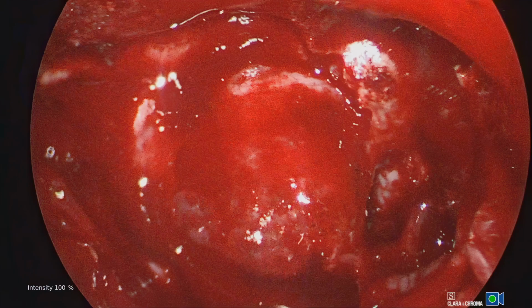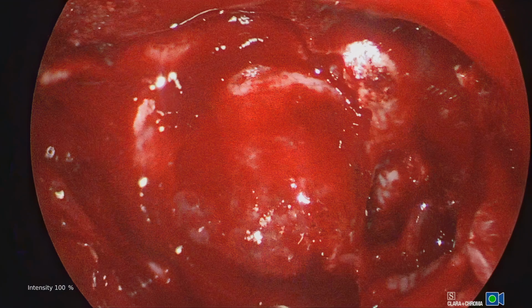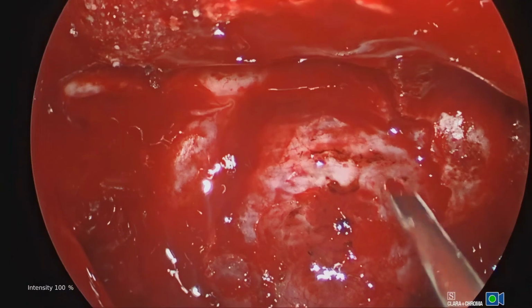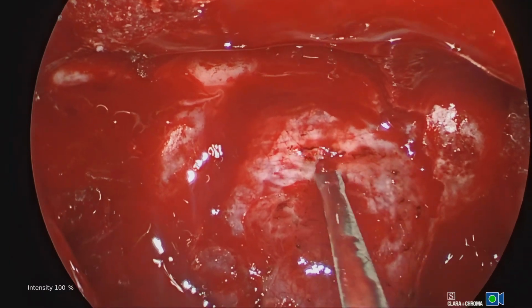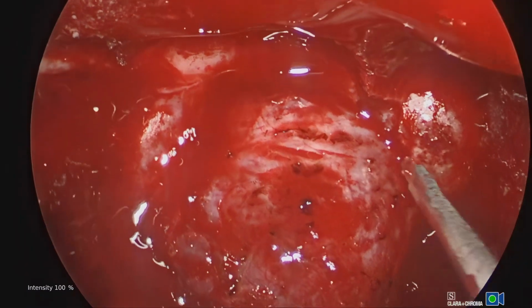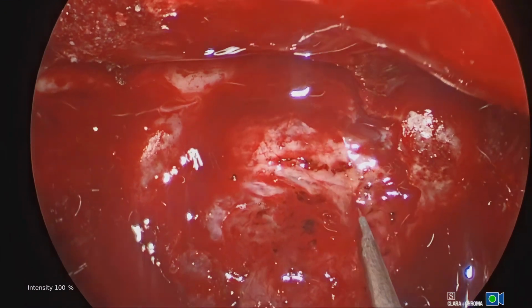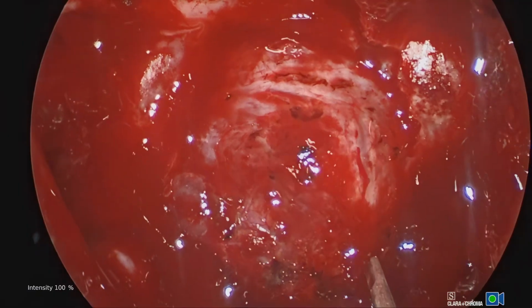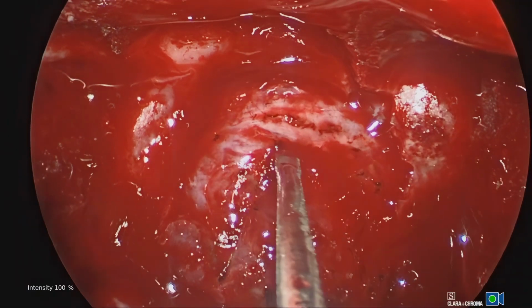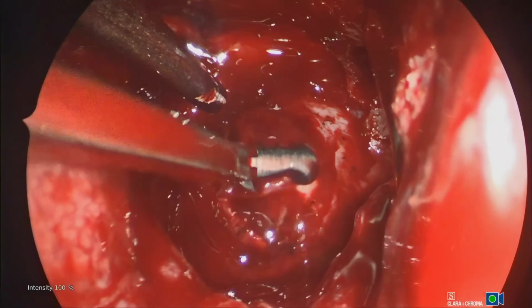Now you can see the optic nerves are represented in the yellow-orange, the carotid arteries in the red, and the sella turcica and the tumor in the green. The bone is left intact over the carotid artery and optic nerves. Now I've removed all the bone over the pituitary, protecting the other delicate structures. We're going to make a window through the dura with a sharp endoscopic blade, and then work on the tumor. It is important to get adequate exposure and not work through a small opening.